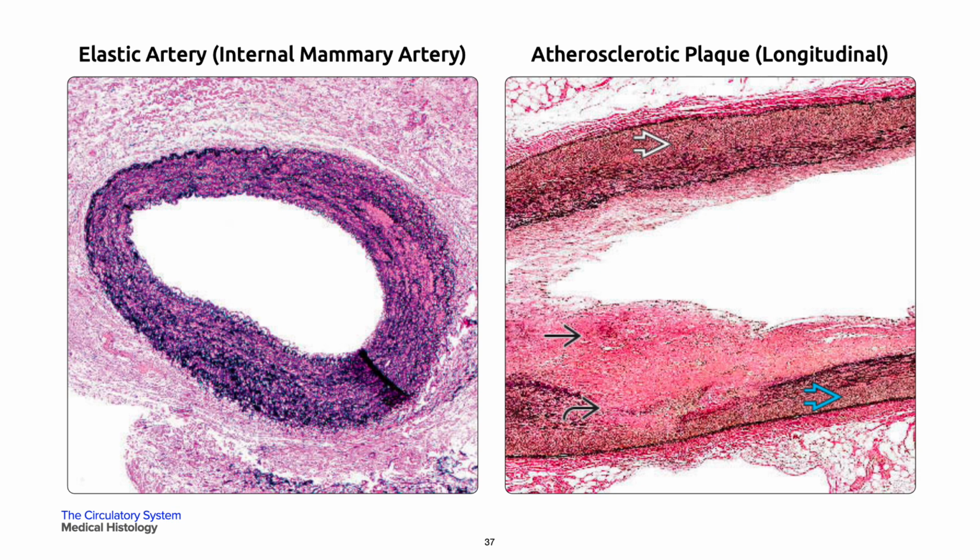On your left is the internal mammary artery, which is unique as the smallest caliber elastic artery in the arterial tree. These are used as conduits in coronary bypass surgery, so this feature is helpful in distinguishing conduit vessels from the native target vessel histologically.